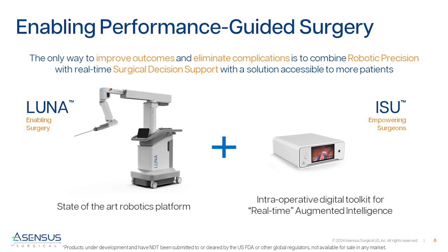The LUNA system is complemented by our Intelligent Surgical Unit, or ISU, a custom-designed medical computer that runs within the operating room during surgery and integrates with the surgeon's vision system. In real-time, it manages several data feeds and controls including the laparoscopic video feed, the robotic platform management, console displays, and more. This real-time information is fully incorporated into the surgical video being seen by the surgeon and dynamically interacts with surgical actions, tool movements, and scene changes. In this way, the ISU provides actionable, real-time information to surgeons when it matters most during an actual surgical procedure.